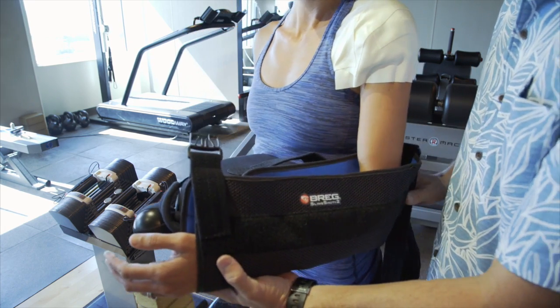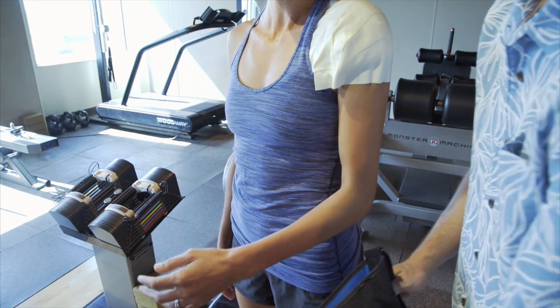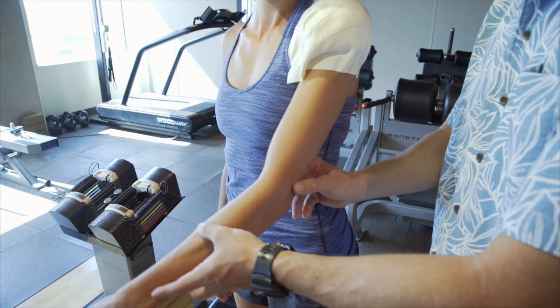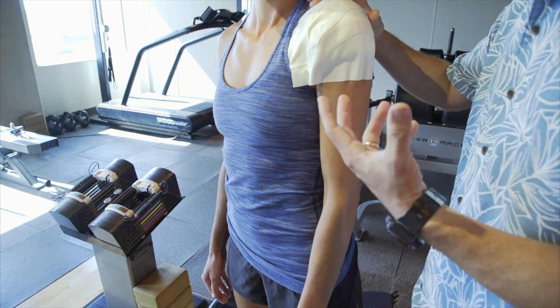Bring it back this way and the entire brace will come out. Slide your arm out and you can let your arm hang down. Now it's important — for things like rotator cuff repairs — not to lift your elbow away from your body or forward. I don't want your rotator cuff firing because it's going to overpower the sutures.